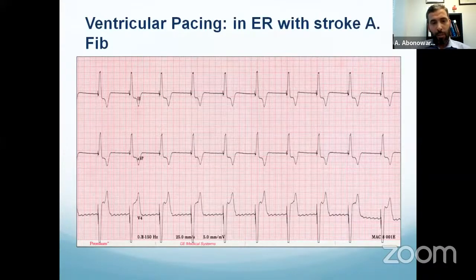Also, this ECG shows ventricular paced rhythm, which is a common finding we see with the pacemaker ECGs. When we look at the ECG, we just look at the pacemaker, sometimes we forget everything else, but this patient also has underlying newly diagnosed atrial fibrillation. So make sure when you have an ECG, look at everything and don't forget, because this patient requires anticoagulation and make sure that you address that. The pacemaker is working well and everything is good, but the patient developed AFib. So we have to deal with that and anticoagulate the patient and usual therapy for that.